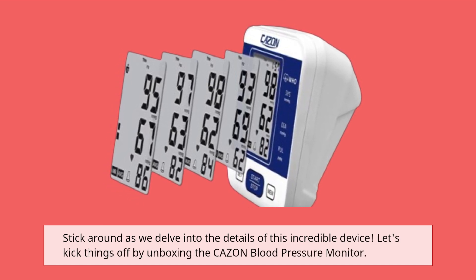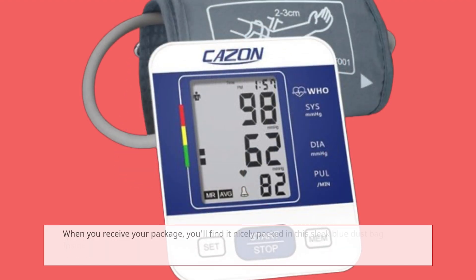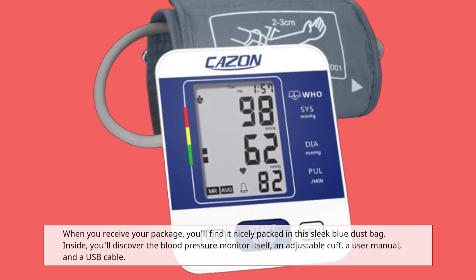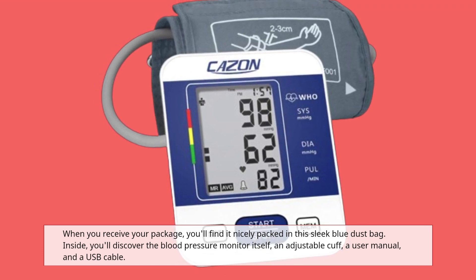Let's kick things off by unboxing the CAZON blood pressure monitor. When you receive your package, you'll find it nicely packed in this sleek blue dust bag. Inside, you'll discover the blood pressure monitor itself, an adjustable cuff, a user manual, and a USB cable.